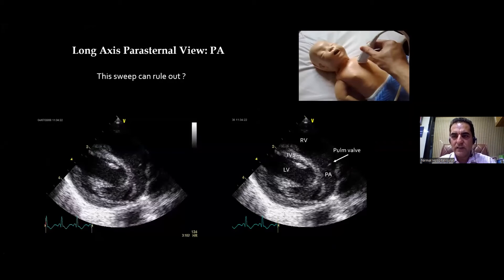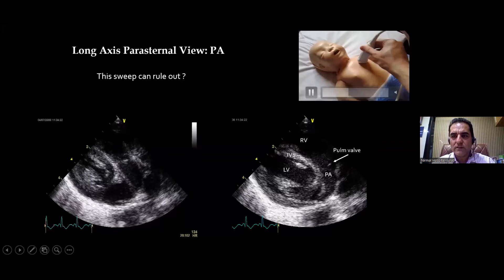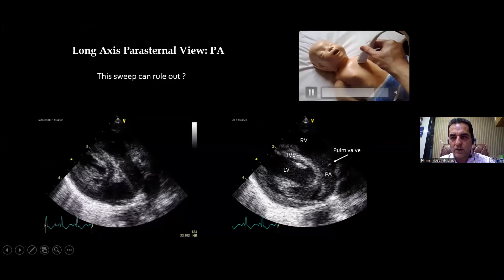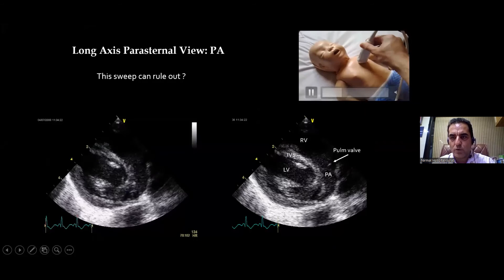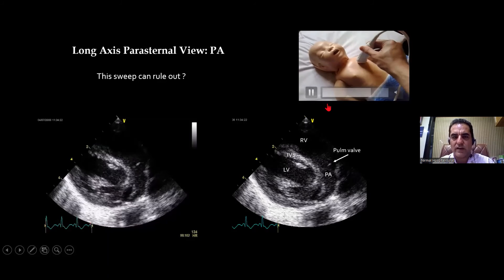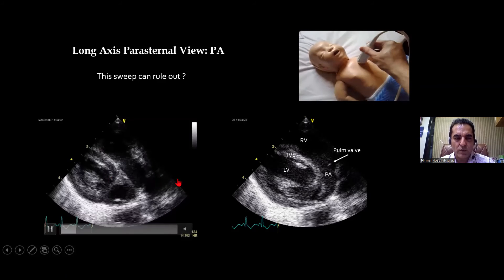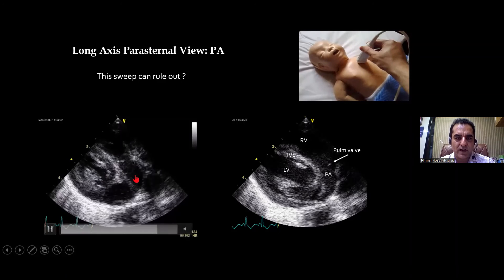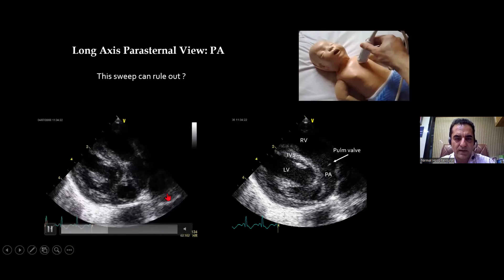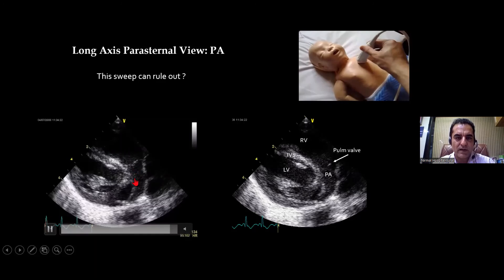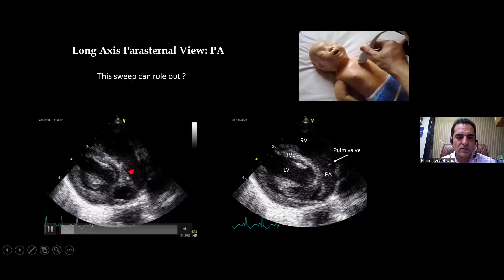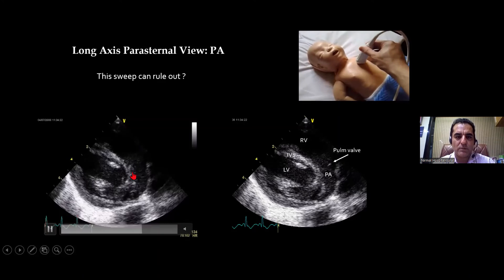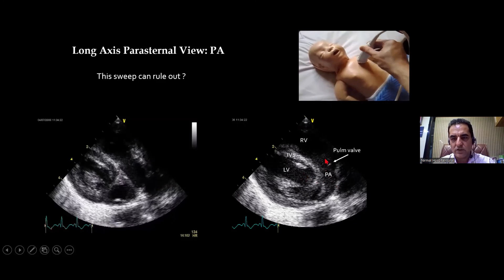As seen in the animation, in the standard parasternal view the probe marker was at 11 o'clock. After sweeping the probe upwards towards the head, the aorta — which was there before — is gone, and perpendicular to it appears another vessel that divides into right pulmonary artery and left pulmonary artery. The pulmonary artery comes from above downwards. This rules out TGA, and you can also perform Doppler of the pulmonary artery in this view.